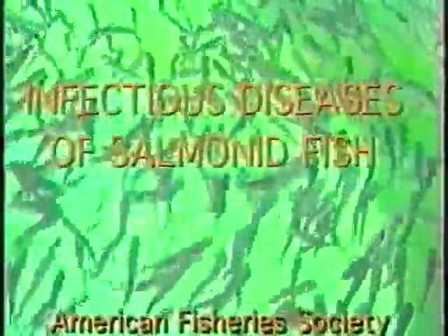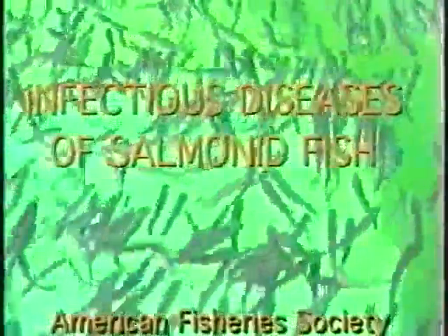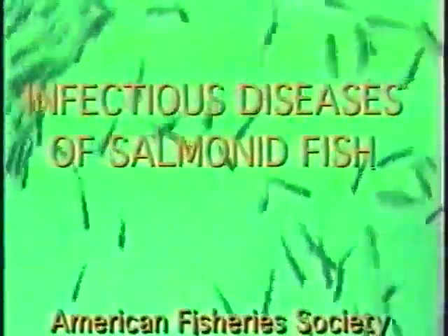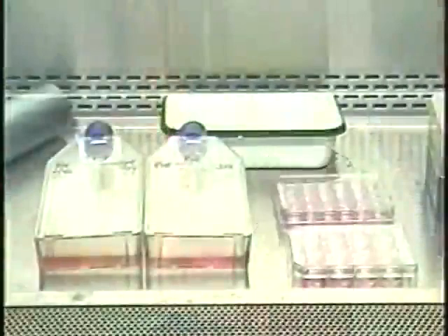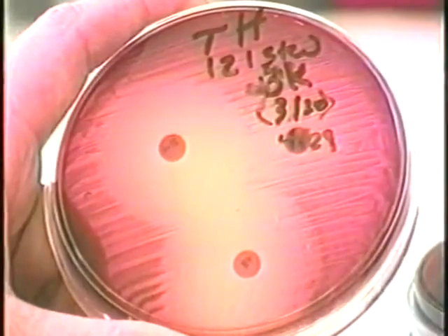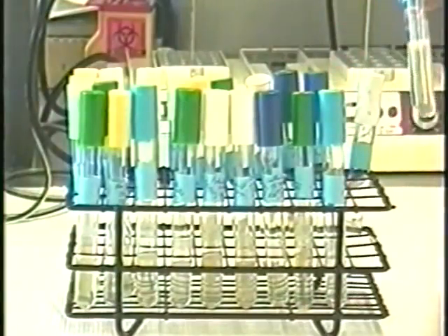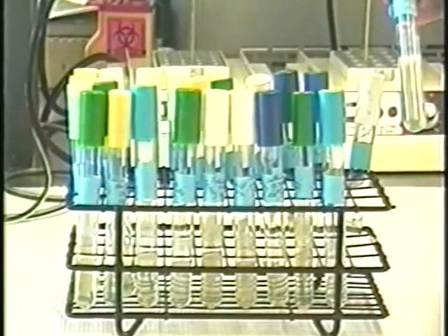to the American Fisheries Society Continuing Education course on infectious diseases of salmonid fish. The video is divided into sections on basic methods, bacteriology, virology, and parasitology. In each section, you will see demonstrations of procedures which have been described in the course text, either as part of a chapter or as an appendix.